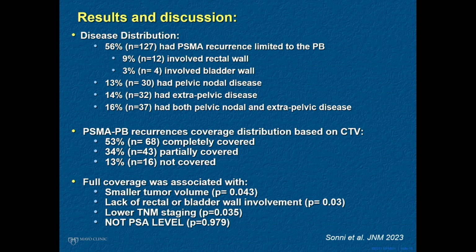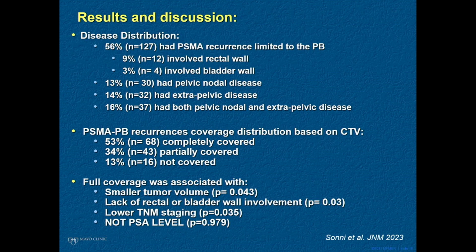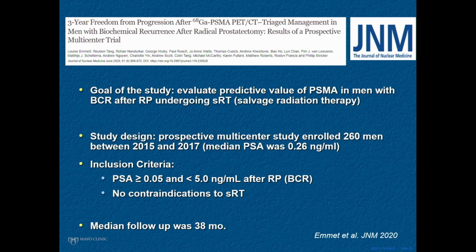This is an example of the potential. Oh, I think I went back, let's see. Example here, you can see that the green line represents the contouring of the salvage radiation, and you can see they would have missed some disease outside. So just to show you the potential value of doing PET imaging prior to salvage radiation, which obviously now is reflected in some of our disciplines' guidelines.